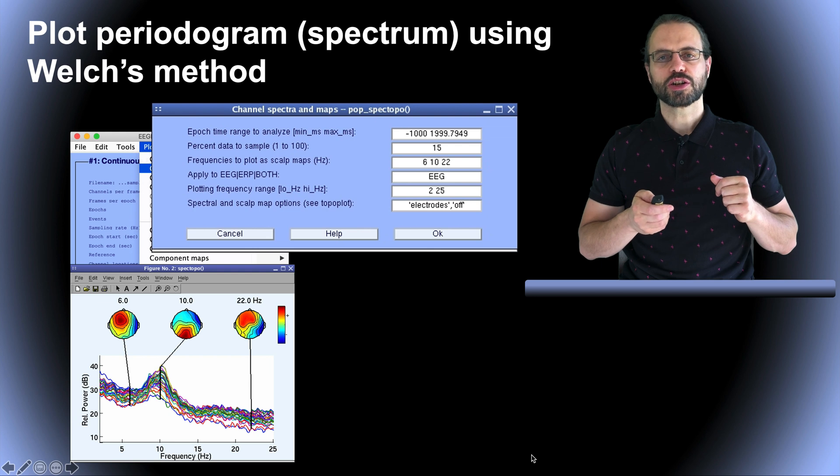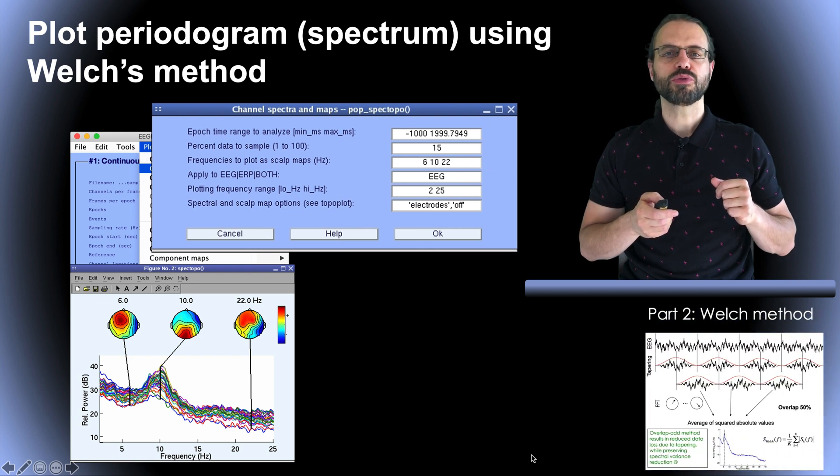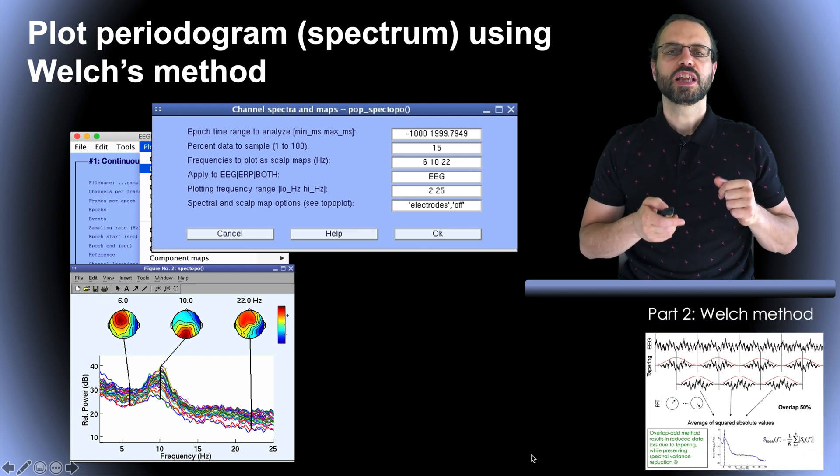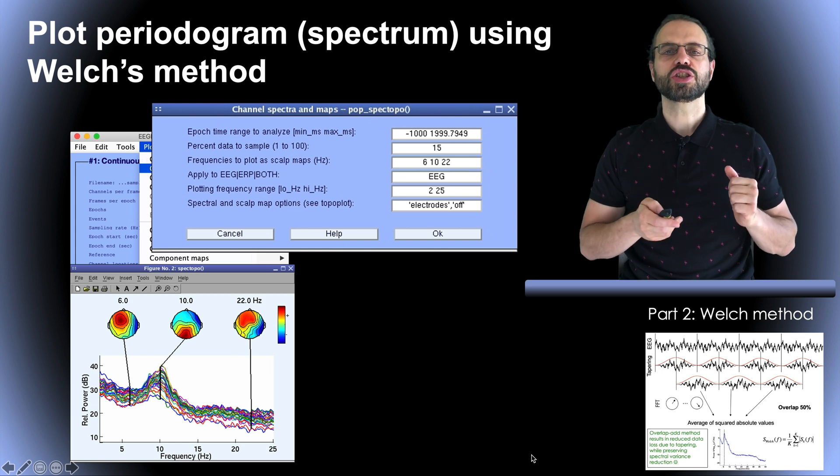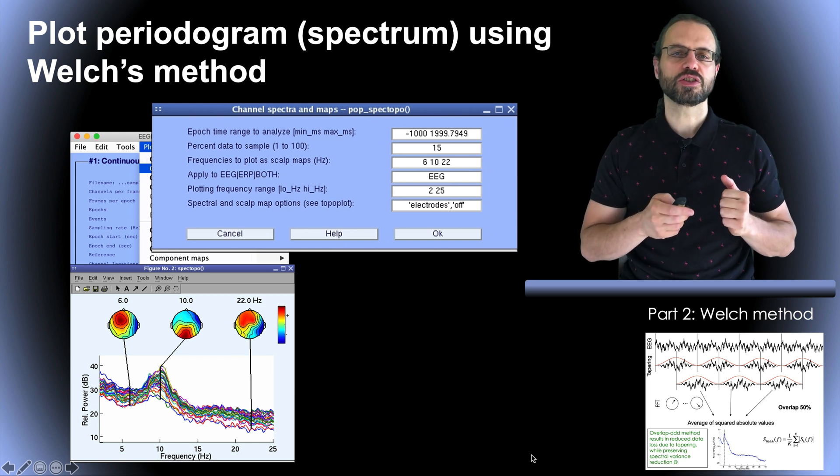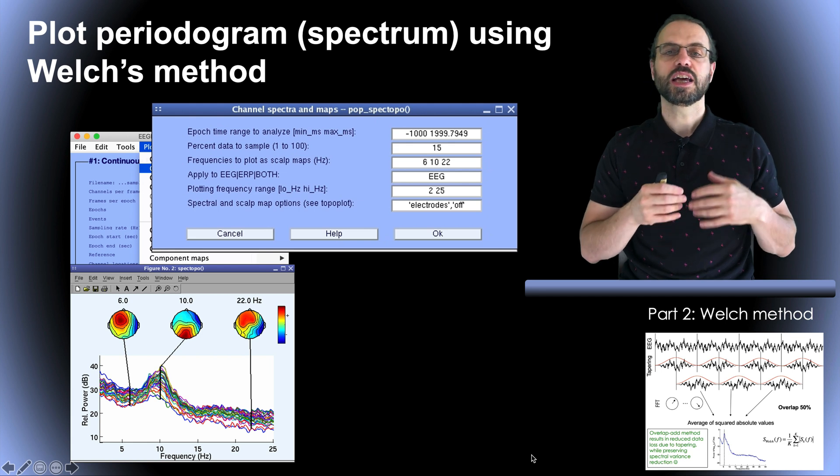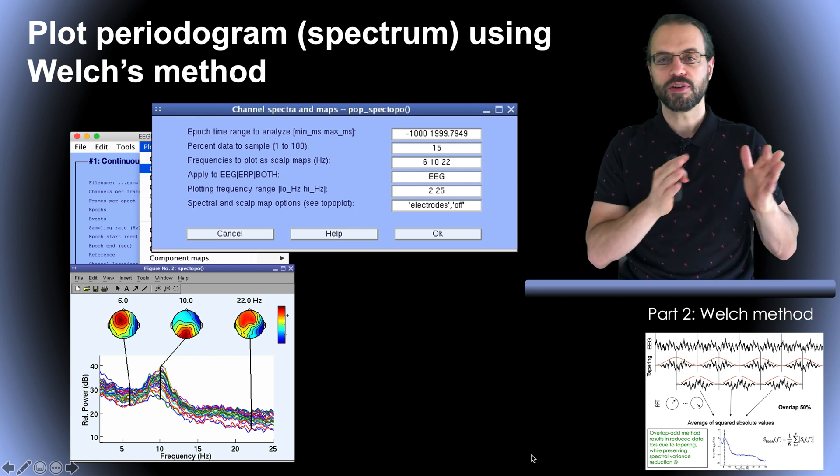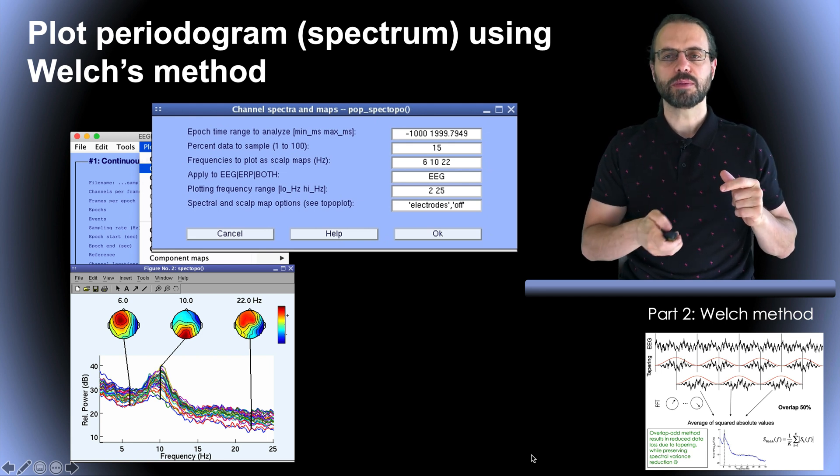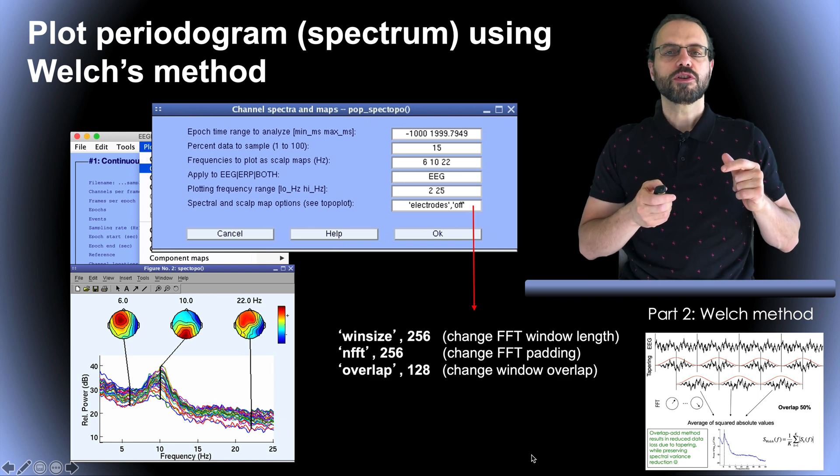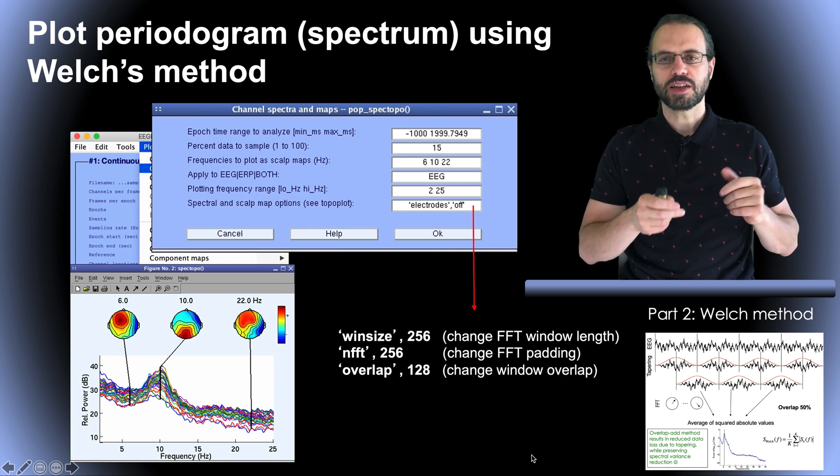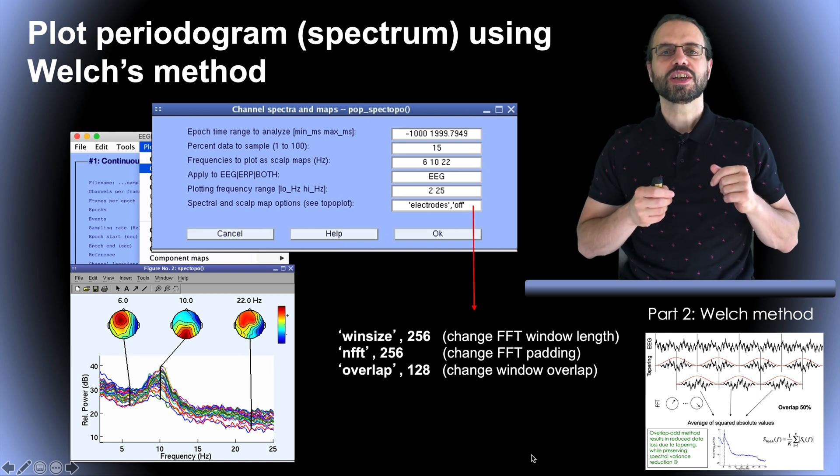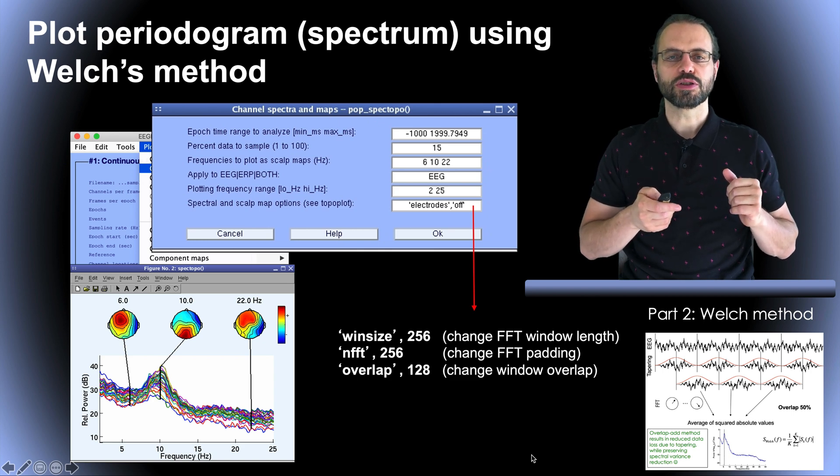So this is the power spectrum of the data using the P-Welch method we've talked about in part 2. Importantly, here you can change the parameter of the Welch method such as the amount of zero padding and the overlap of the windows by typing them in the edit box. Also, if you look at the MATLAB command line, which you cannot see here, you can see details about the Welch method parameters.